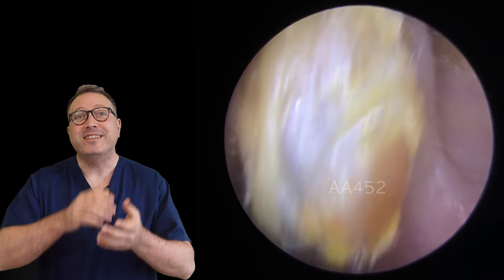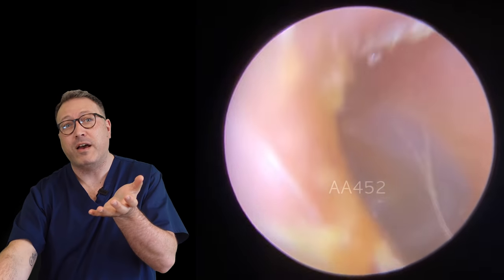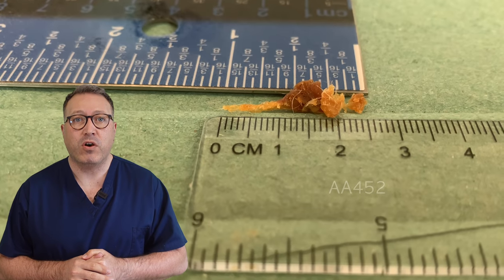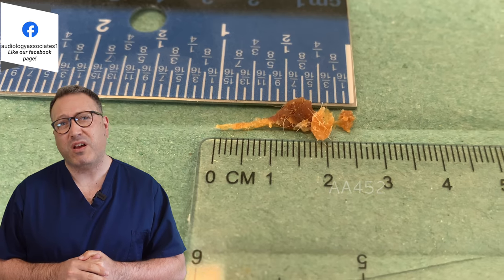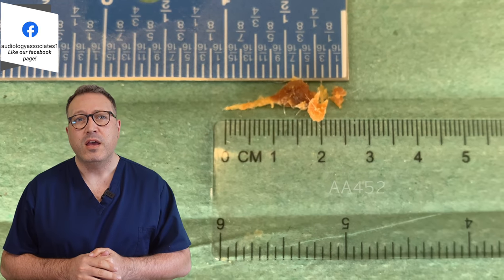There we are — you can see that skin layer underneath there, forming the whole length of that plug. And there's the eardrum, looking nice and healthy. So we've got about two and a half centimeters — an inch of wax — for this one as well.